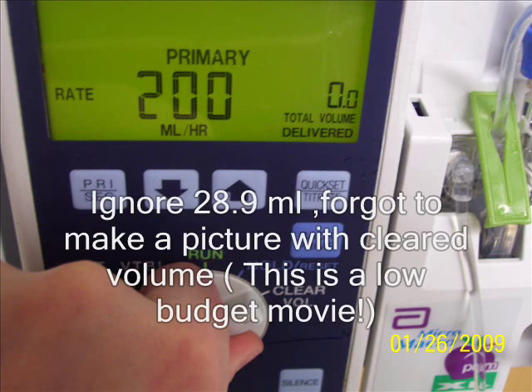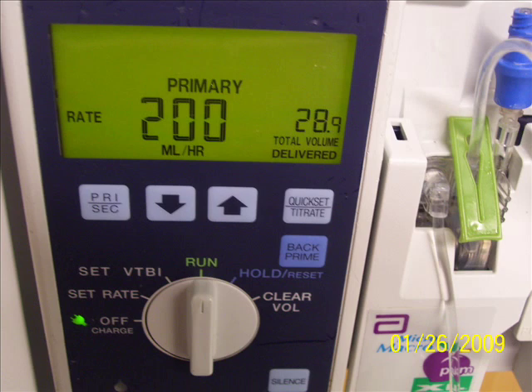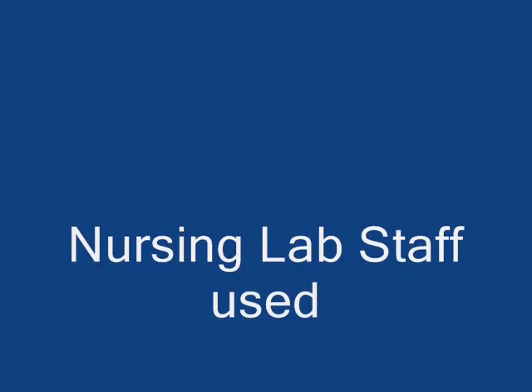And returning back to the run. Now ignore those 28.9 milliliters because I forgot to take one more picture with the cleared volume, but I believe you got a picture of what it is. So this is the easy way to learn the pump. We encourage you to come to the lab and practice more.